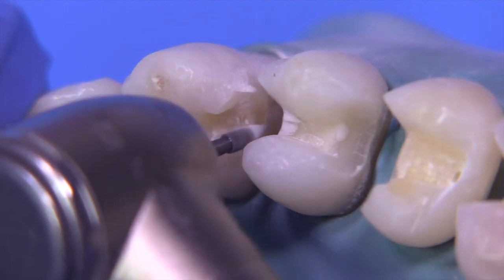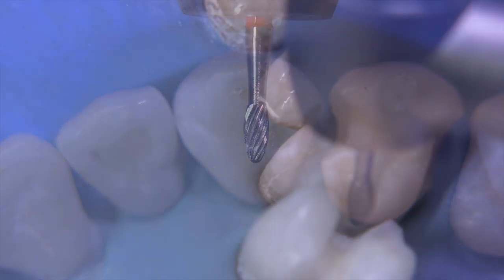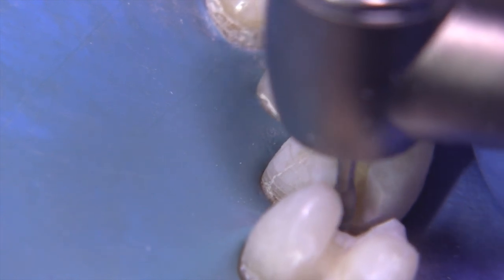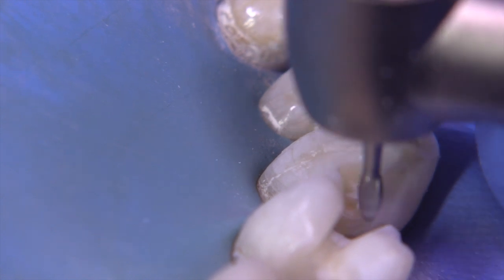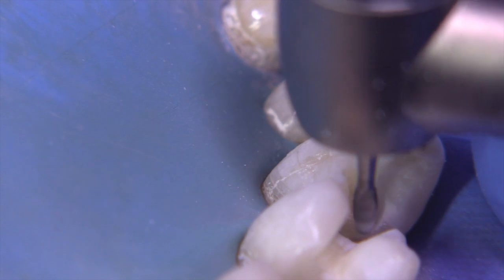So now we're going to switch over to the 7404. Holding the burr along the line of draw of the preparation that you established on the lingual, just tipping the burr lingually — just allow the burr to do the work for you — creating a little bit of bulk in the middle of the interproximal area.